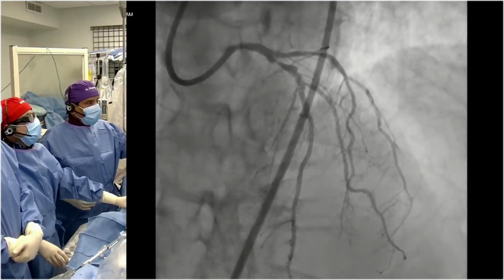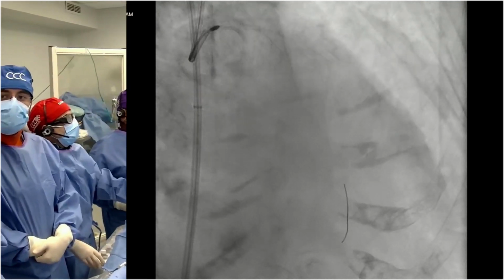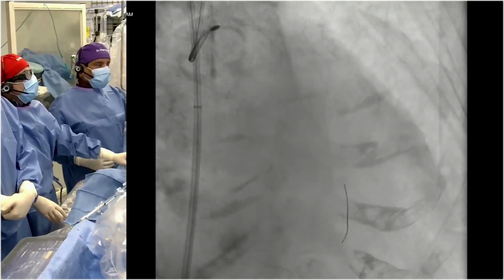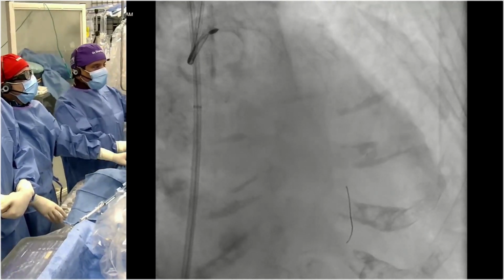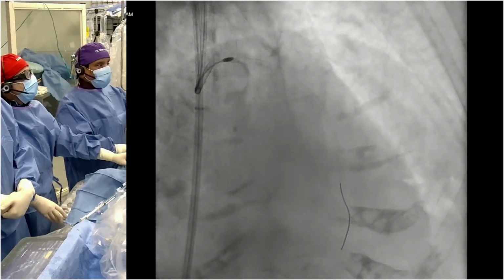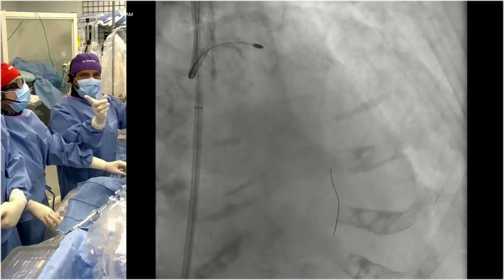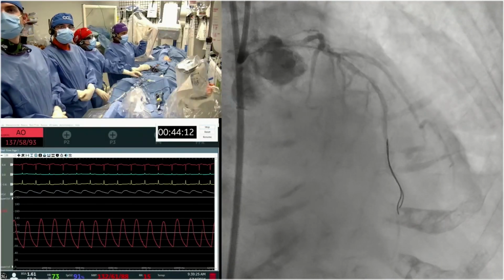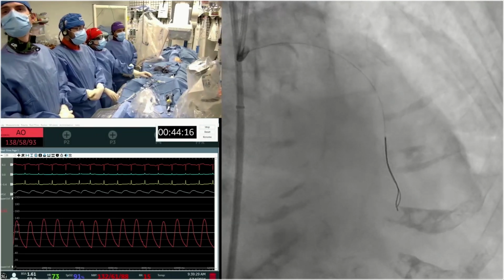I know with the time constraint, what we did is we went ahead, knowing there's so much calcium, we did a 1.75 burr, tremendous slow flow. We got transient high ST elevation. With this, first we used the Rota extra support wire, ostial left main. Then the LAD was very tough with a 1.75 burr. That's what caused the slow flow, but transient. And can we show the EKG also, please? So it also looks like she kind of stopped her heart rate, slow flow, and these are very important. Then the patient also developed hemodynamic compromise here.